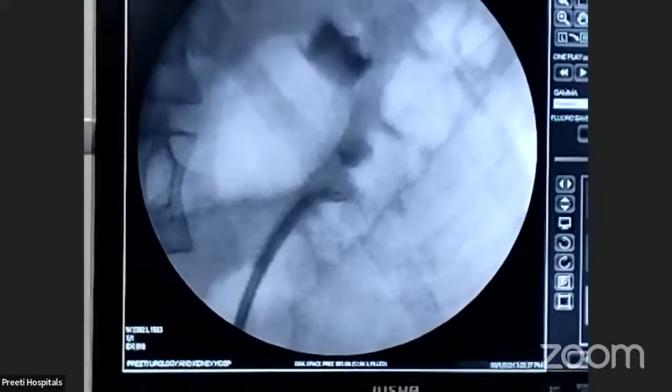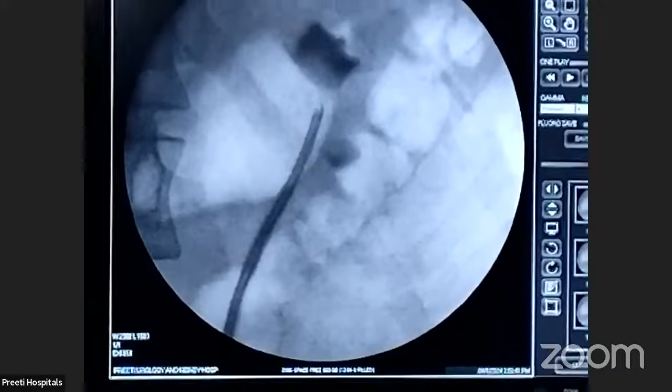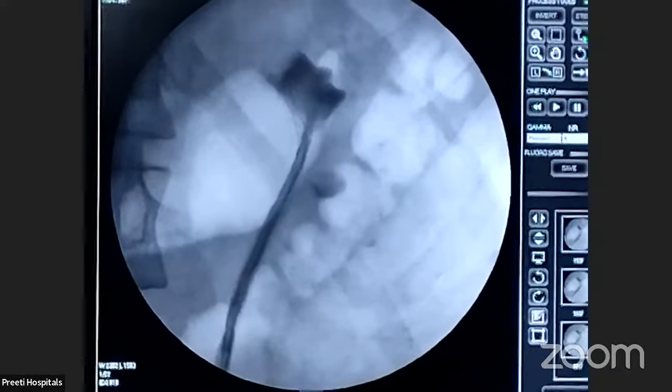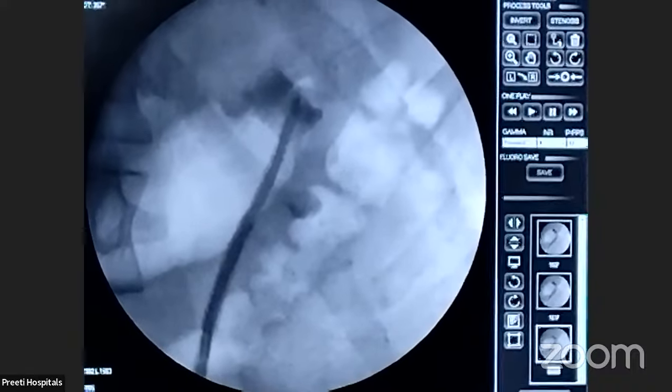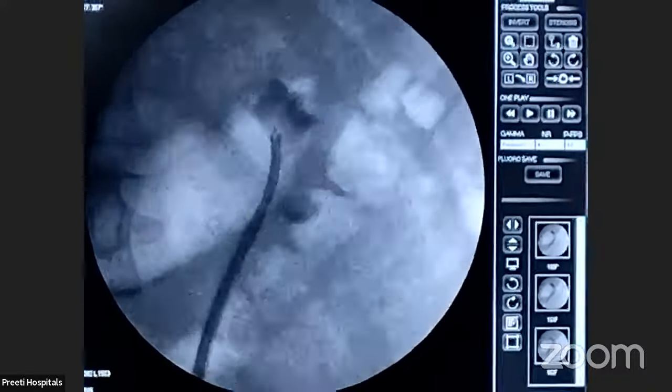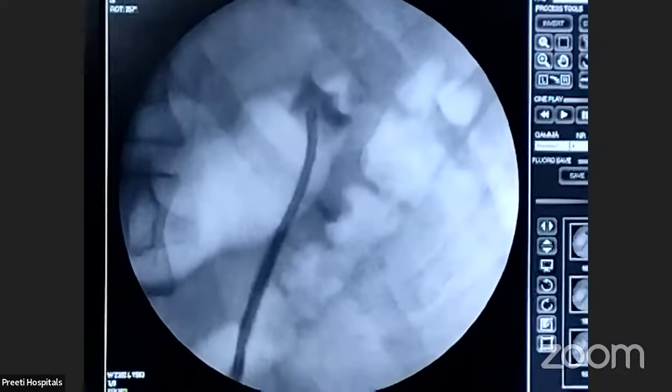Suck. That's all. Now, don't flush more, Ramakrishna. Suck it out. See, upper calyx also, suck out. See, it's a large calyx, so it will take time to suck out, sir. Suck. Don't flush, Ramakrishna. Let him suck out. Lightly flush. Flush. Suck.